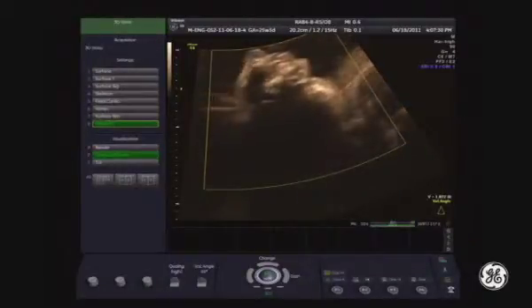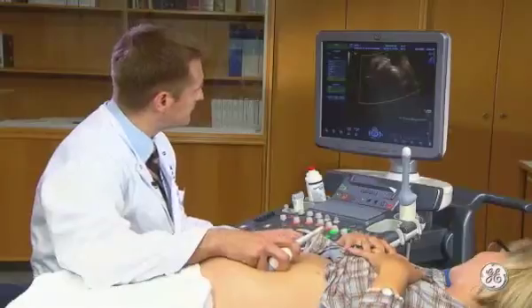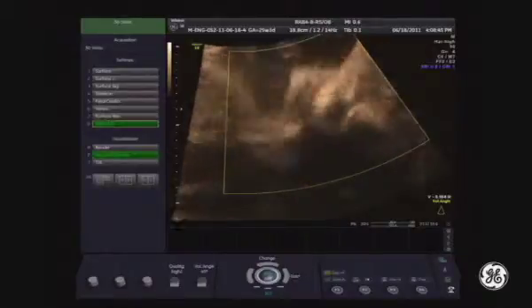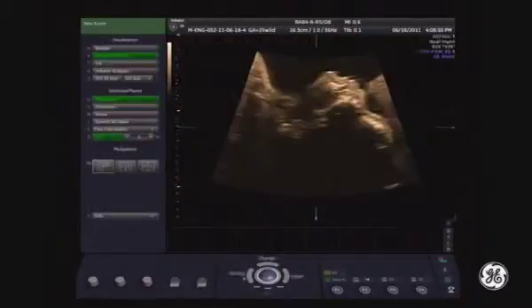And this baby is not so still here. So we need to wait. When it shines bright, you release the acquisition trigger and you perform your acquisition.